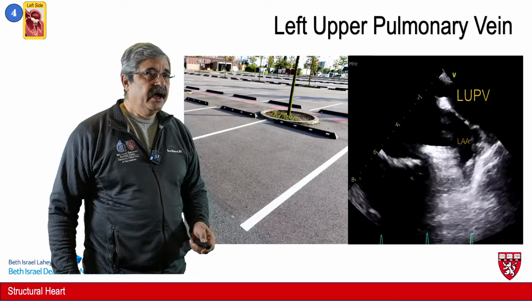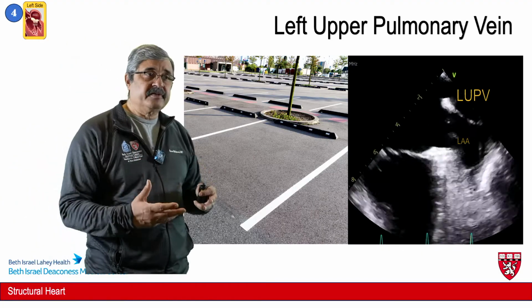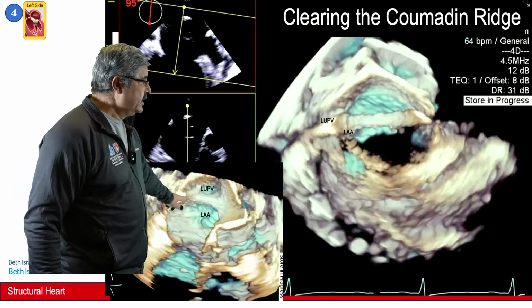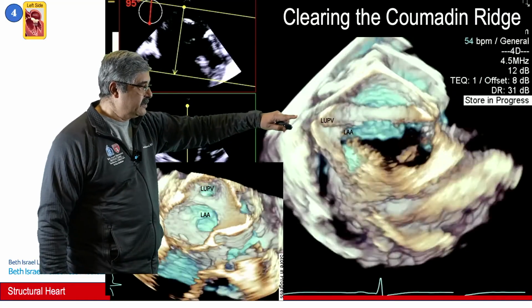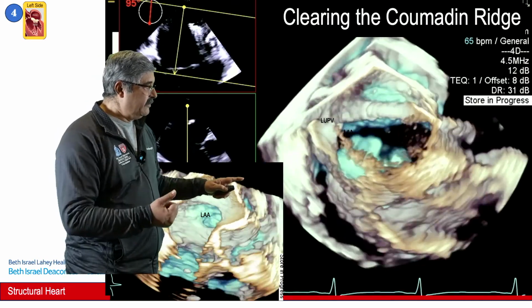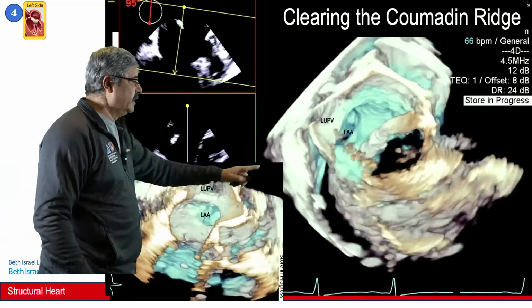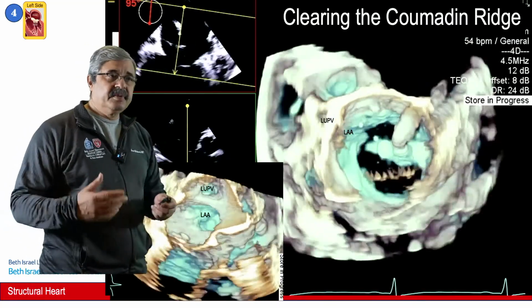Because in this entire parking lot, this is a safe, known parking spot where you can park the catheters before we start moving. It's a good reference point to start moving your catheters in a very dilated, large left atrium. For example, in this video, you can see right over here is the Coumadin ridge, left upper pulmonary vein, left atrial appendage. And in this graphic, you can see that the catheter is parked in the left upper pulmonary vein. The procedure is pulling it back over the Coumadin ridge into the left atrium and avoiding the left atrial appendage, going right over. See that moment they crossed over this Coumadin ridge into the cavity of the left atrium right over here, and now they will straighten it, avoiding the left atrial appendage, and going over the mitral valve. So that's the process of doing this.